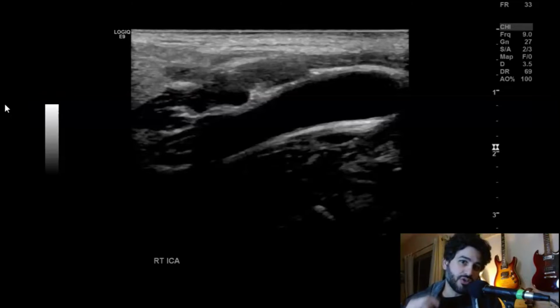We're going to go over a transcranial Doppler. This is a normal study. I just wanted to show you how I do it. I've done videos where I'm scanning myself before. This one's just going to be pretty much the protocol I do.